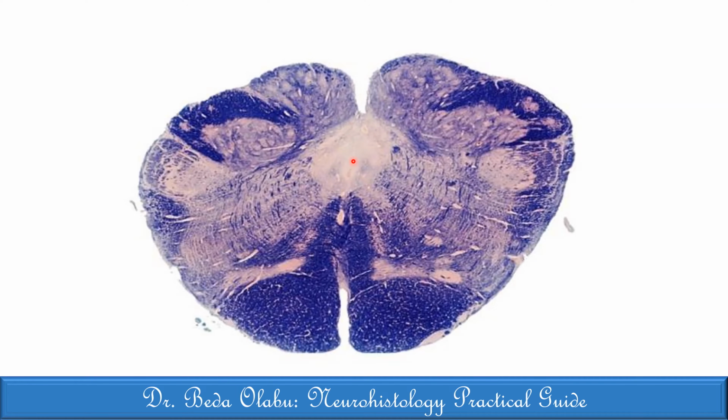Going more dorsally, we find the fasciculus cuneatus and the fasciculus gracilis with their nuclei. The whitish parts, which we couldn't identify, were the cuneate and gracilis nuclei, and slightly below it, more lateral, that's the spinal trigeminal tract and nucleus. Yeah, I think that's it.